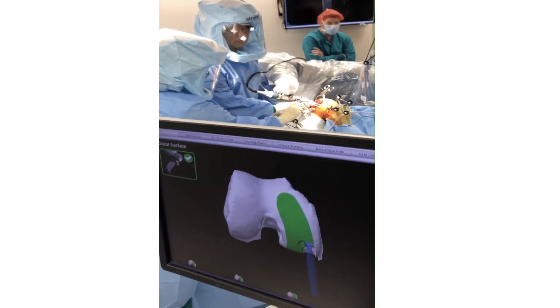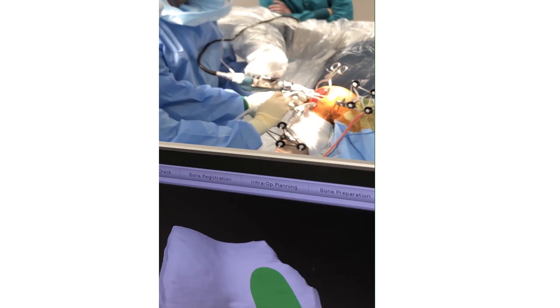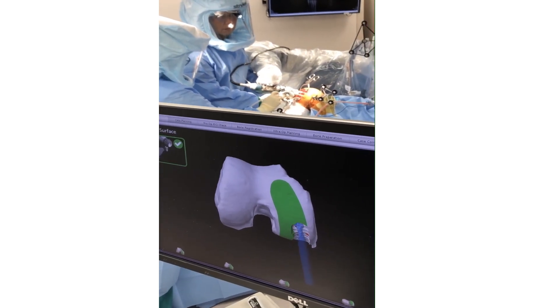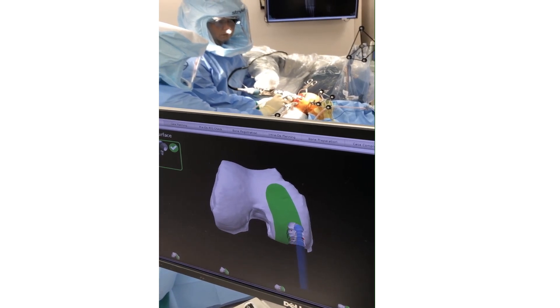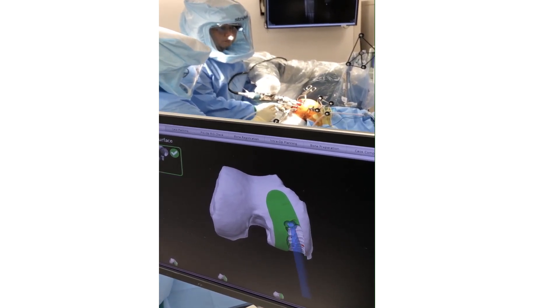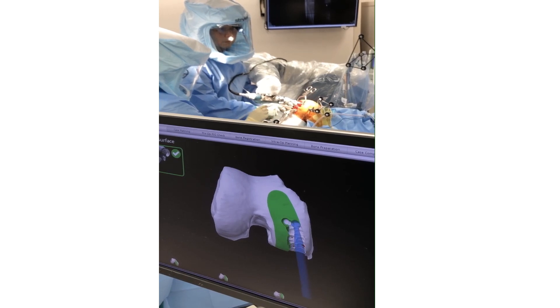This is how surgery works, where I'm looking both at the patient and at this virtual screen. The area that needs to be fixed is highlighted in green, and the native bone itself is highlighted in white. We use the robot, which is connected by hardware and software to our preoperative plan, and as I'm doing the surgery, the robot gently follows me along as I guide it.